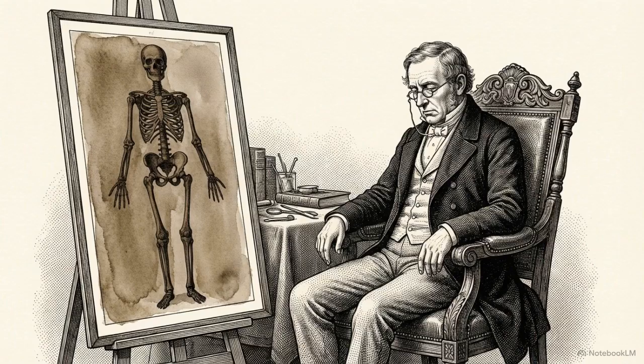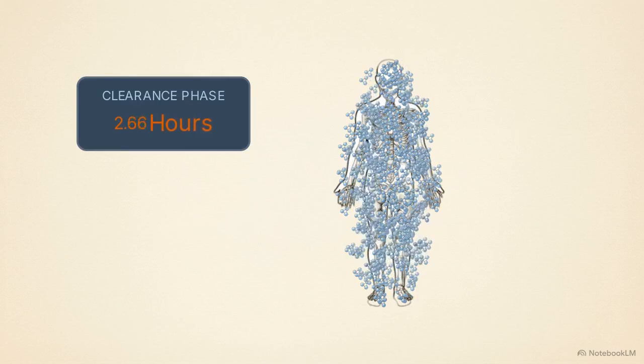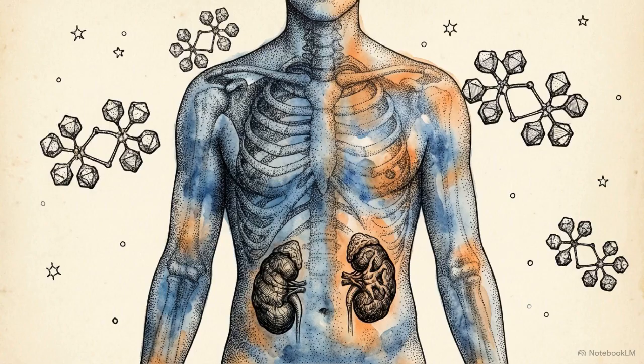In nuclear medicine, a completely uniform scan missing its normal soft tissue landmarks is often the final indicator of systemic collapse. The TC-MDP modality relies entirely on precise timing and optimal physiological clearance to generate a diagnostic image. Poor renal function or soft tissue noise can overwhelm the skeletal signal, making the underlying pathology indistinguishable from the background.